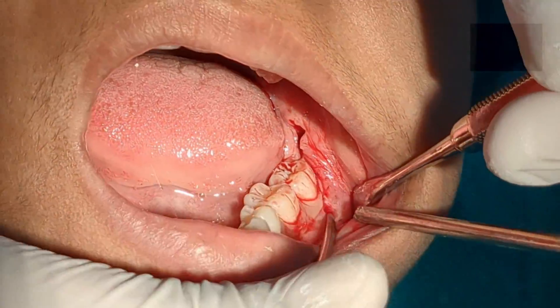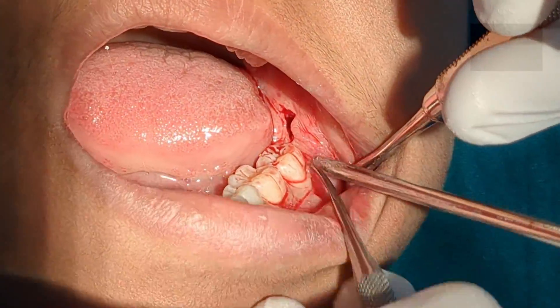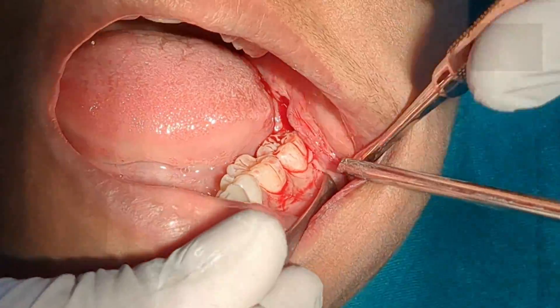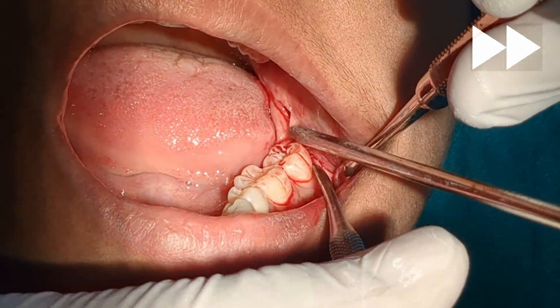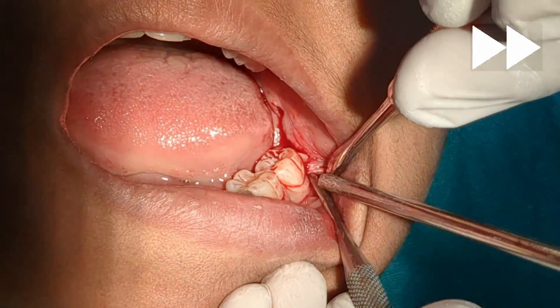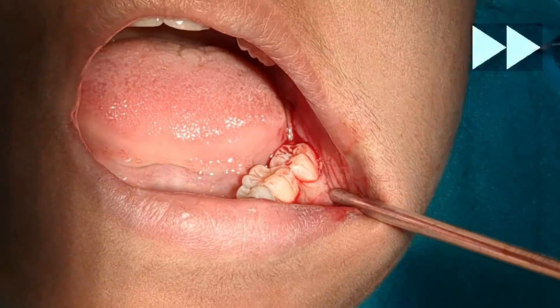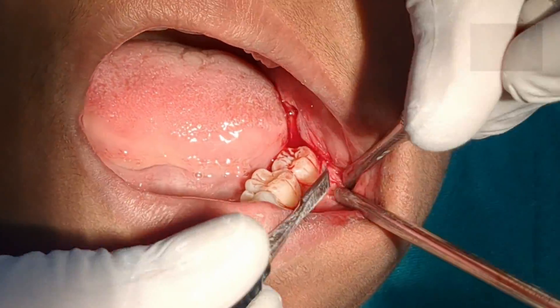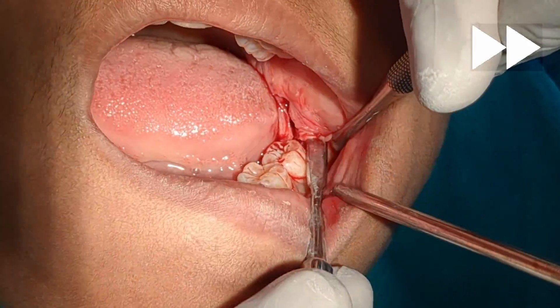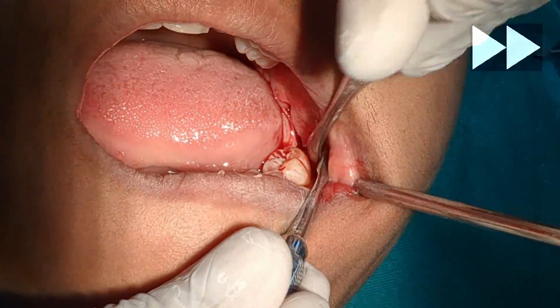I start reflection of the mucoperiosteal flap from the anterior releasing incision, and then I proceed backwards, making sure that I do not tear the periosteum. A torn periosteum can lead to unnecessary intraoperative bleeding, which can be a nuisance for the surgeon.